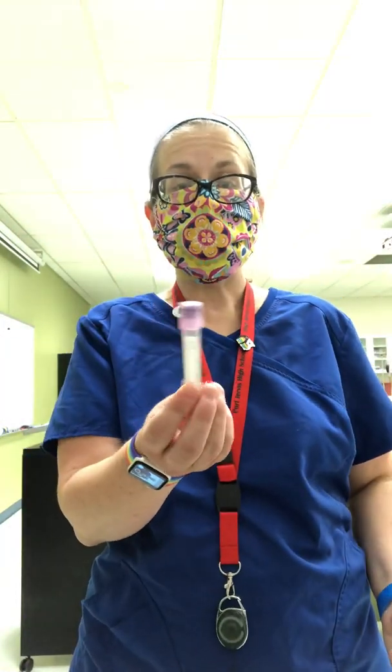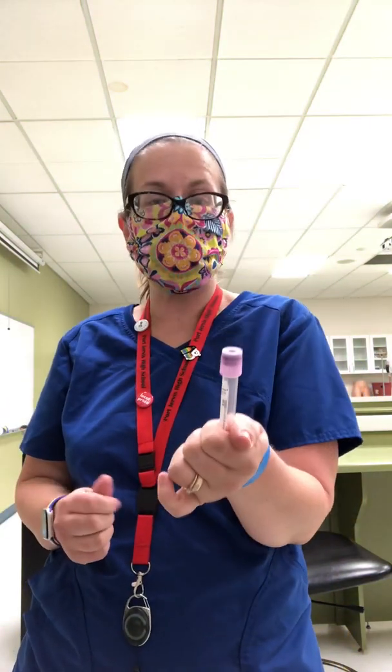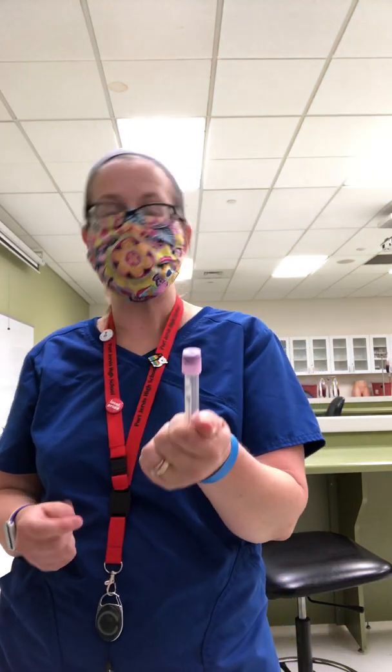Next is lavender. Lavender contains EDTA. Anything that's a hematology study goes in here. The most common test drawn in lavender is the CBC. ESR — erythrocyte sedimentation rate — also goes in here.